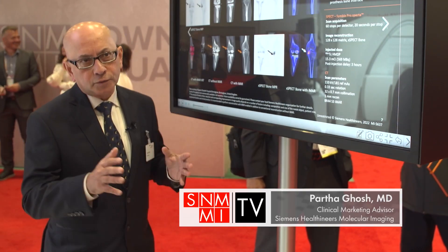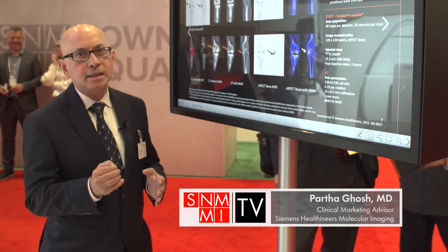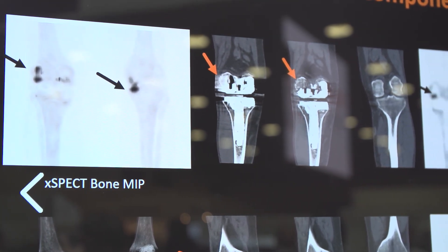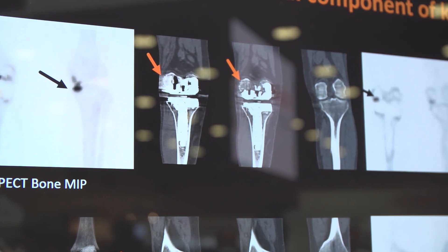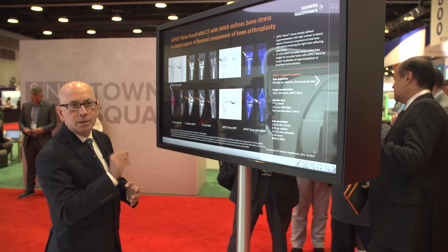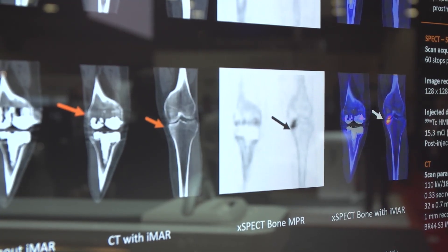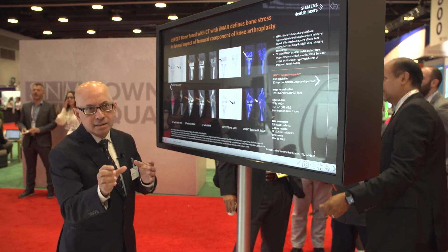One of the major advantages of the Symbia Prospecta is the ability to deliver really high quality CT with thin slices, along with metal artifact reduction capability. You can see an example of a patient with a right-sided total knee arthroplasty prosthesis who has pain, and with the SPECT bone imaging we can show a small focal hypermetabolism. With metal artifact reduction on CT, it becomes really useful in defining the exact position, localization, and characterization of the lesion.